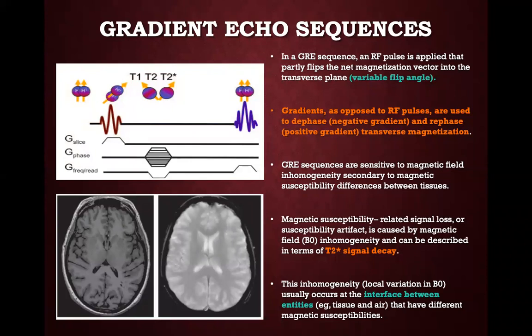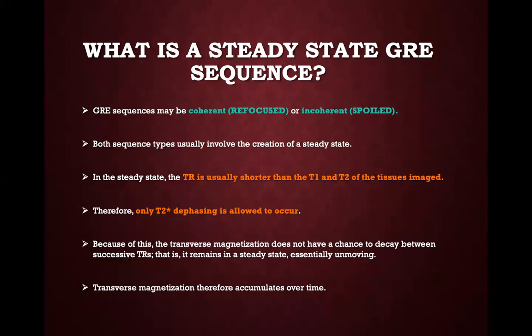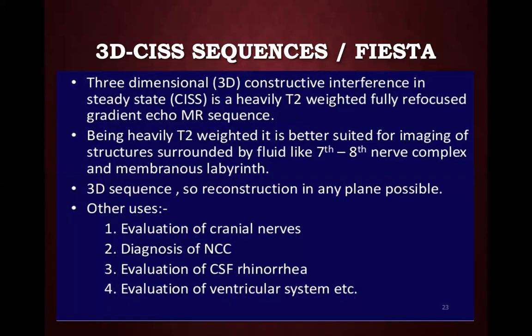Again, gradient echo, don't bother about the physics of it. Remember just this slide. The best example for a gradient echo sequence is 3D CISS, or CISS 3D, or FIESTA.